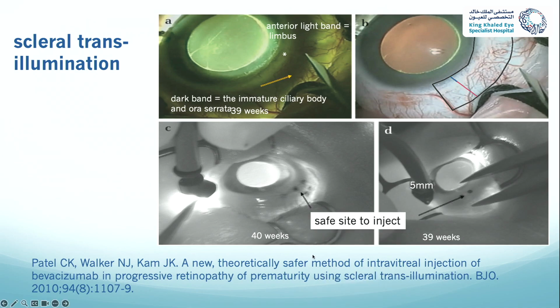So what's the distance? We can see a caliper was put in here, which is set at 5 millimeters. So this marking here, you can see that is probably about a couple of millimeters at most, right? That's what he has noted in his observational experience.